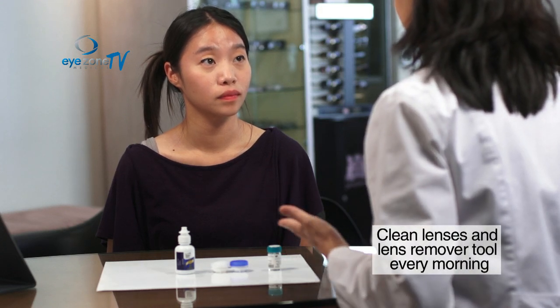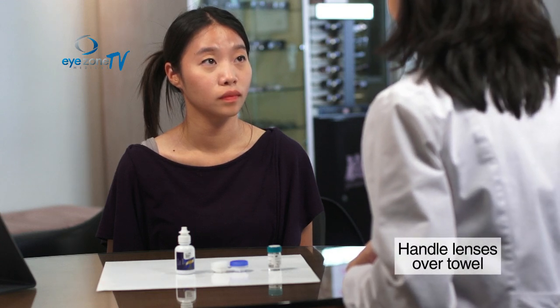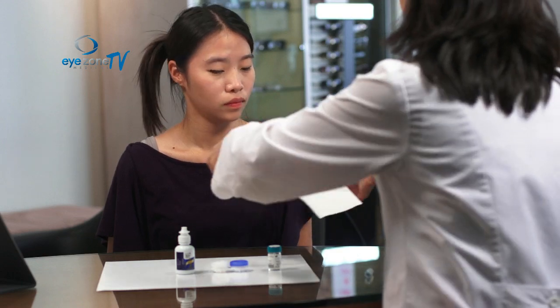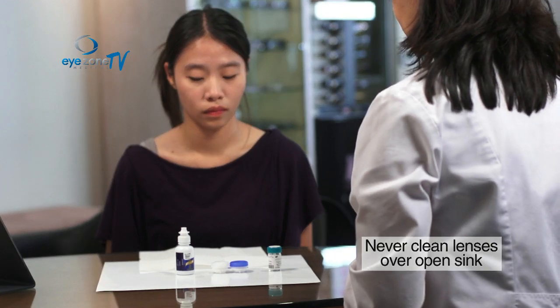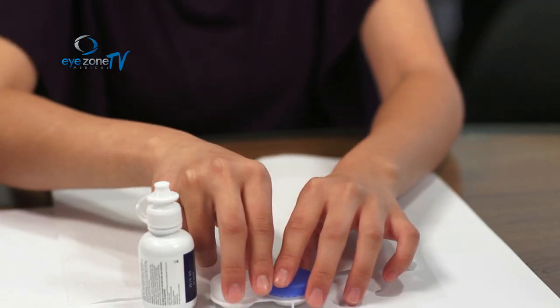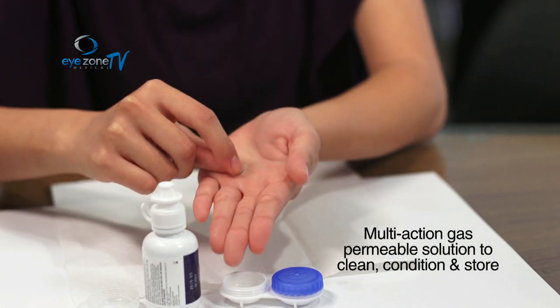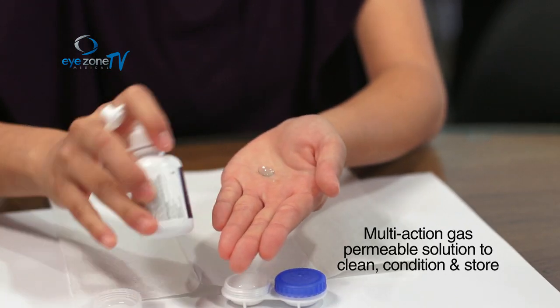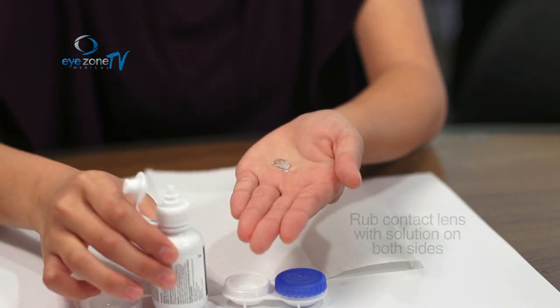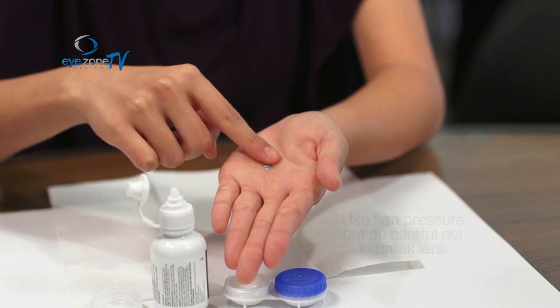Now that your contact lens is out, you need to wash it every morning so it's clean and ready to use at night. When cleaning, always do it over a towel or paper towel on the counter — you don't want to lose it down the sink. Take the lens in your hand, apply a few drops of the multi-action solution — one or two drops is all you need — then rub the contact lens on both sides for thorough cleaning.